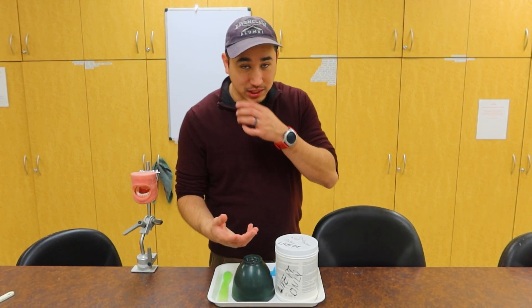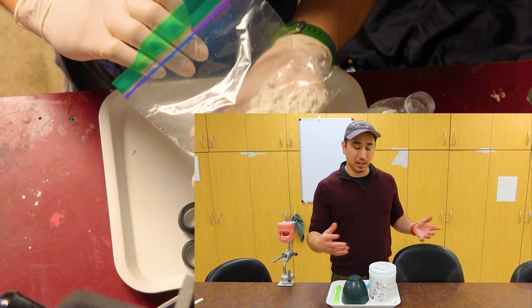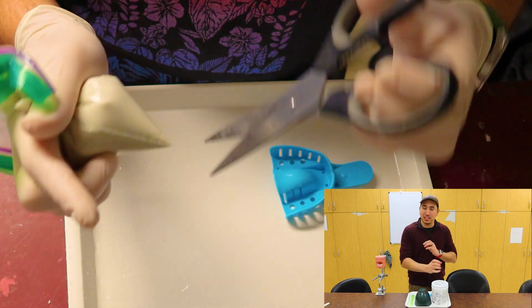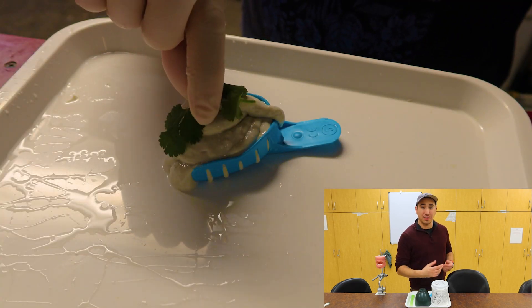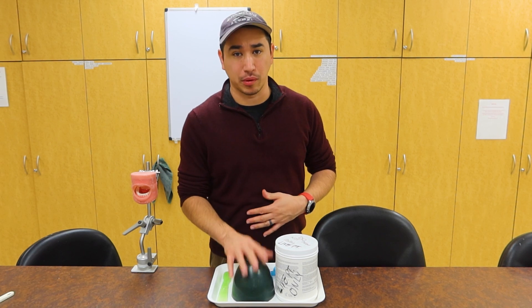One of the main important things is what are you going to mix it in? Now there are a couple of techniques out there, such as putting our alginate in a bag, throwing in some water, rubbing and spinning it around, and piping it into our tray. That's cool if you want to look like a superstar, but for us we're usually going to be using some type of mixing bowl.